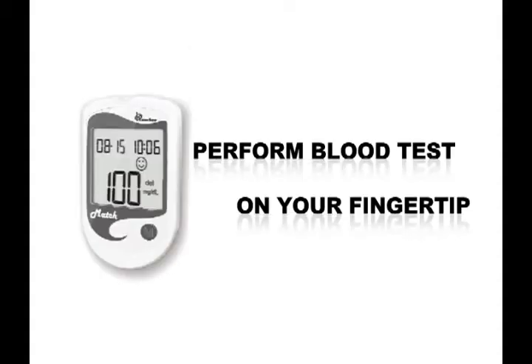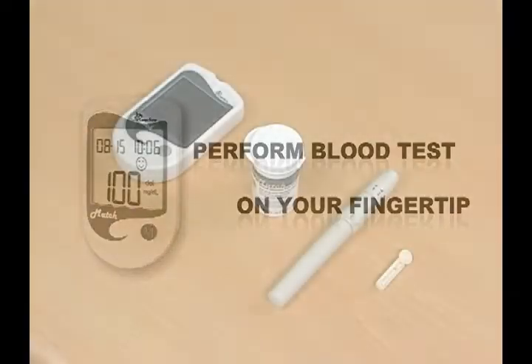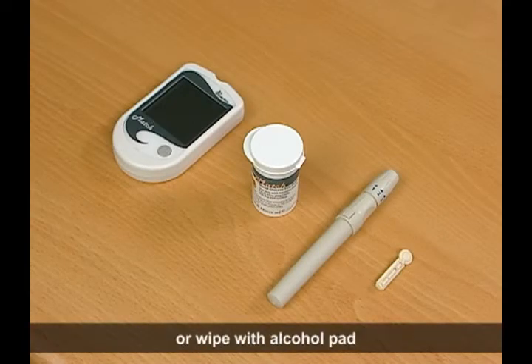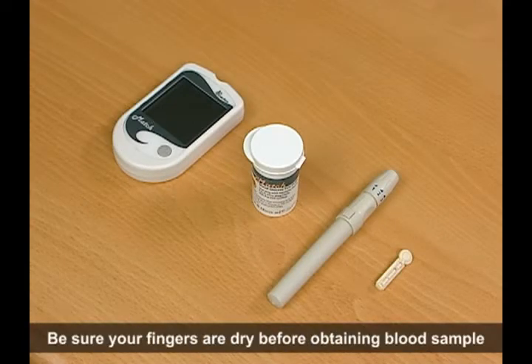Perform blood tests on your fingertip. Wash your hands in warm soapy water, or wipe with an alcohol pad. Be sure your fingers are dry before obtaining a blood sample.